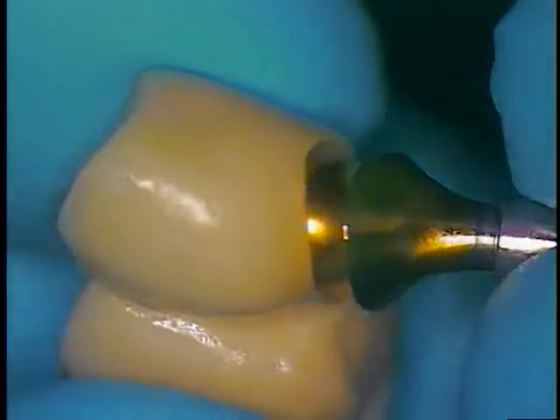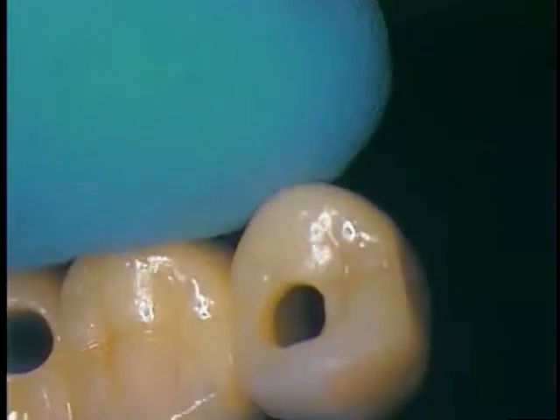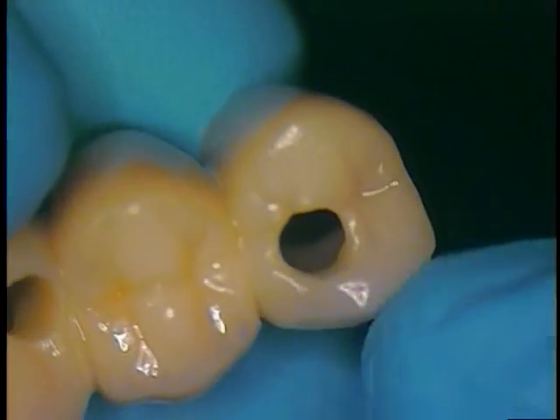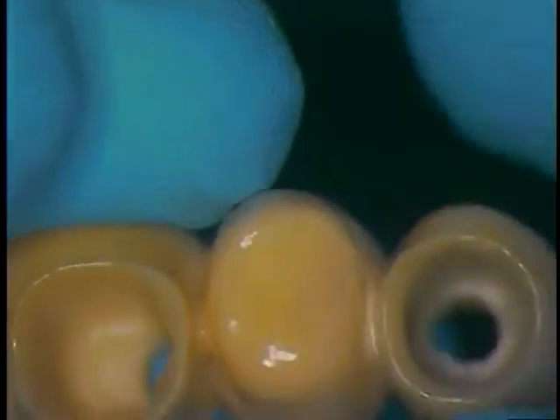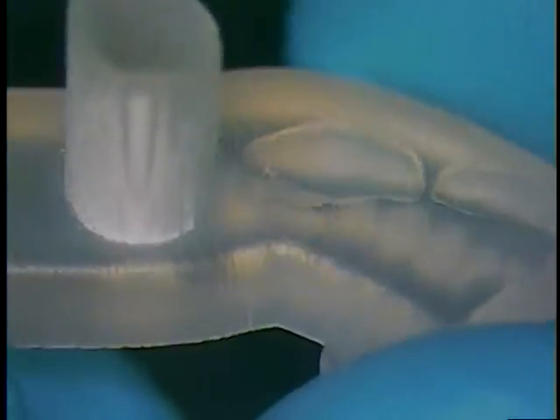We'll do the same thing with the other — this one doesn't have the material in it. I still have to try this in. If you look straight down here, it's got a good seat, doesn't rock at all, and easy access. We'll squirt that material with the yellow tip all the way down in the middle of that abutment and make sure it seats properly. We had the occlusal portion of this tooth — the incisal edge, or the occlusal buccal cusp tip, added a little bit. We also had the pontic space tightened up a little bit. I opened up the embrasures a little bit more and we'll verify occlusion. So in the mouth we go. This is our try-in jig, and this is printed from the lab — it's all printed, and each of the abutments line up with that.